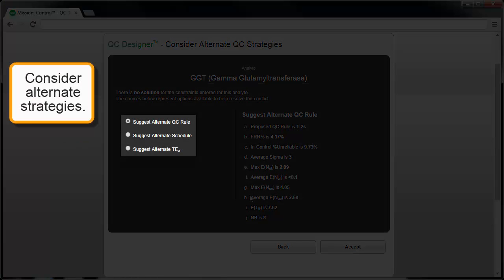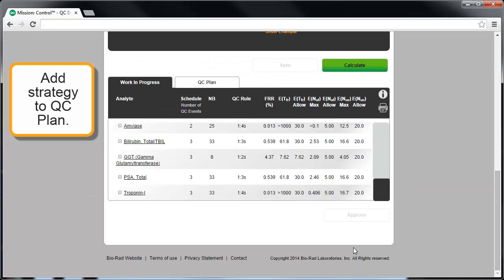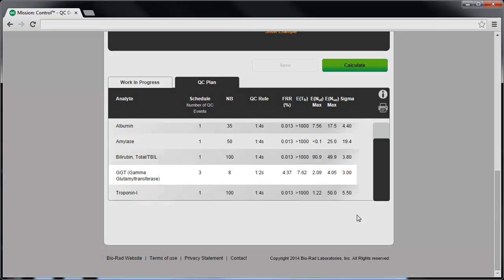In this example, there are three options to help resolve the conflict. The first is to consider an alternative QC rule, suggested as 1-2-S. The second is to consider an alternative schedule of 25 QC events per day. The third is to consider an alternative allowable total error specification (TEA), recommended to be 14%. In this case, we'll select the alternative rule of 1-2-S and click Accept. The Work in Progress tab now shows the accepted alternate QC strategy for GGT as a solution. Selecting the GGT row and clicking Approve moves the solution into the QC Plan, which now shows GGT included.